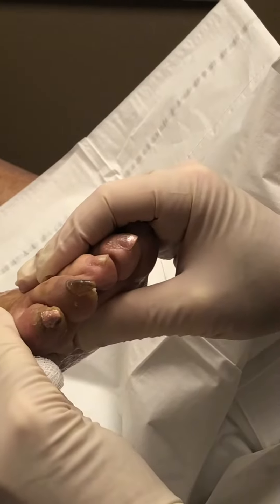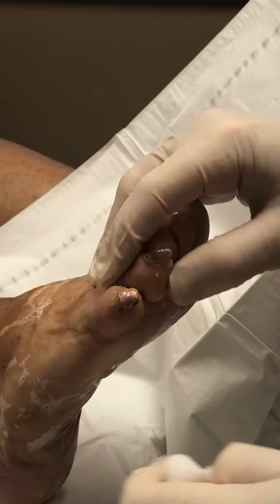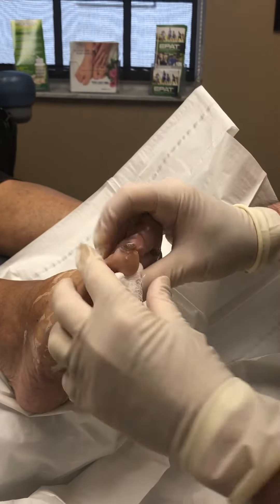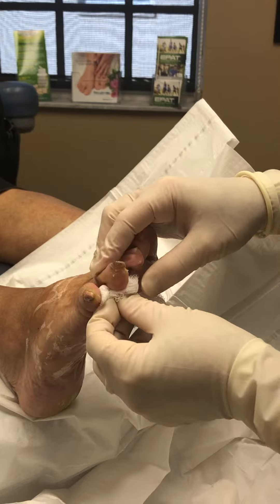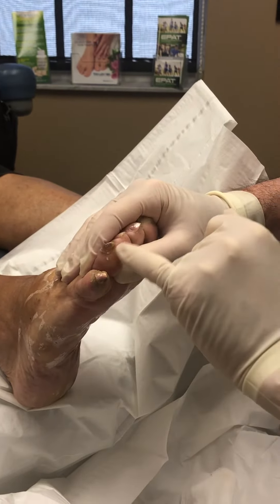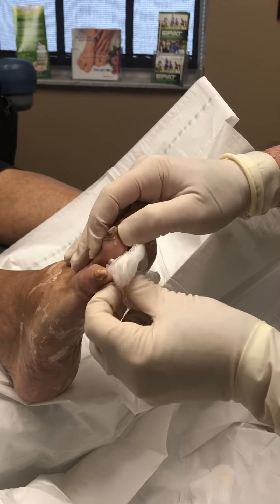It's definitely a lot straighter now, not as rotated up underneath. This toe has had previous surgery, so I believe this is the optimal result. We will splint the toe in position, and I believe the patient will have a much straighter toe with less pressure on the tip, therefore reducing the callus and pressure against the other toe as well.